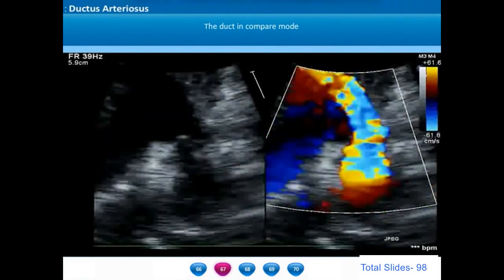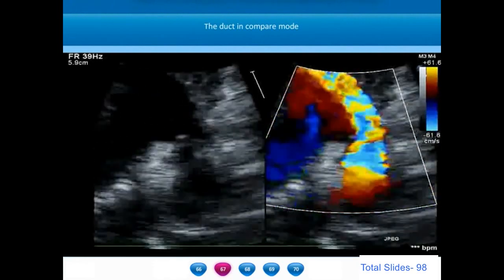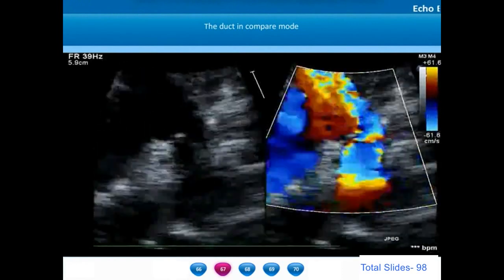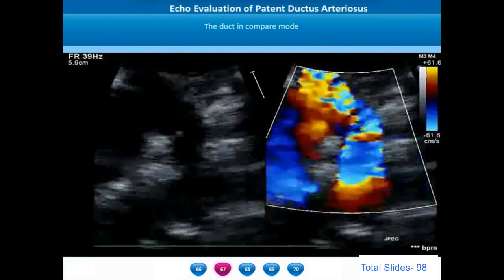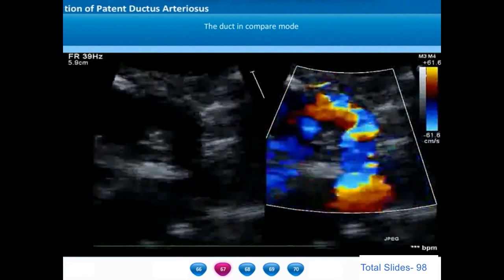However, if the same ductus is a tubular duct with the same 6 millimeter diameter, an 8-6 ductal device will not completely occlude this ductus arteriosus, will need a significant oversizing or sometimes an entirely different strategy.